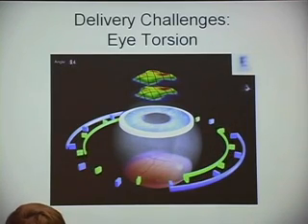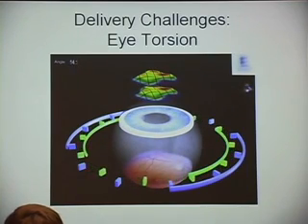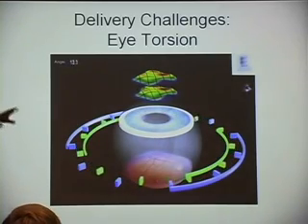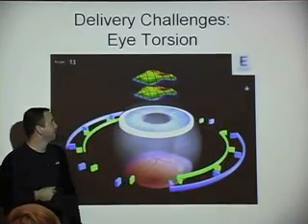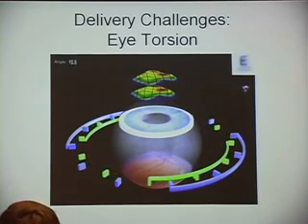And so that matters to us if we're measuring these little aberrations. And this is another visualization of what would happen if you tried to correct those errors and you got the angle wrong. So all right, pretty good sharp focus, nice point spread function when everything's aligned. If you measure them at one angle and you treat them off. So real eyes usually only change a few degrees, 4 or 5, but they can change as many as 15, which is what I'm showing here.